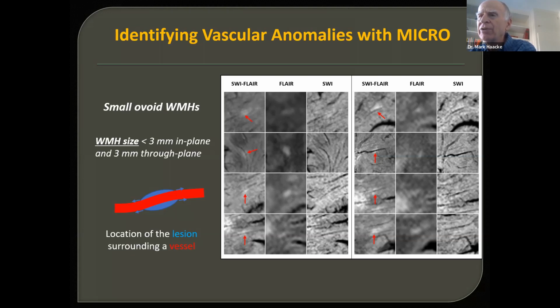And if we can monitor the presence or absence of these developing inflammatory regions, it may bring us a lot closer to understanding what's happening in MS.